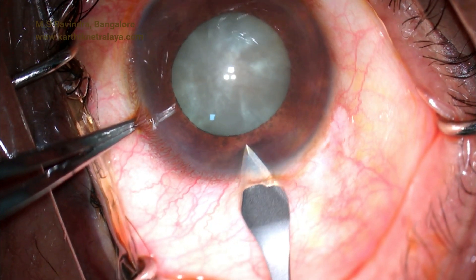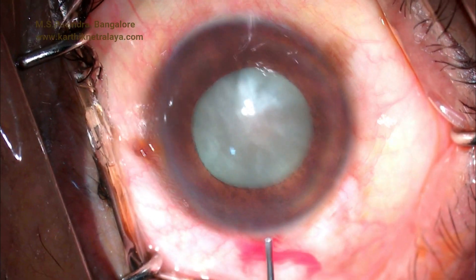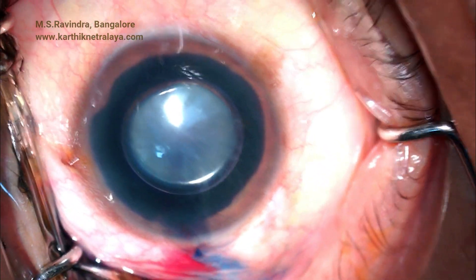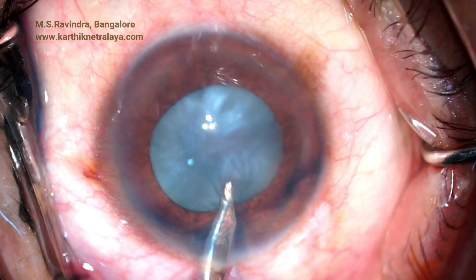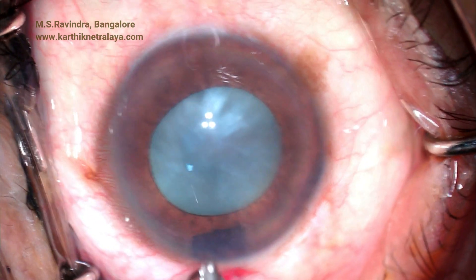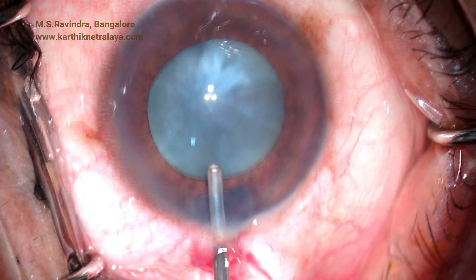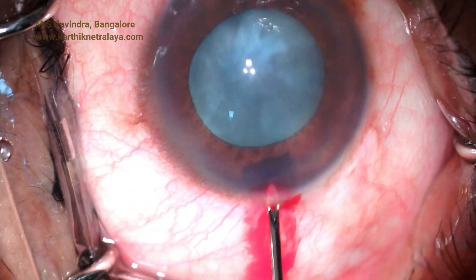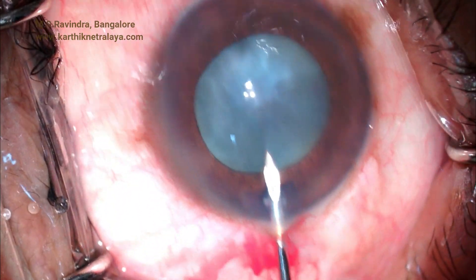An over-mature Morgagnian cataract appears to have a very tense capsular bag. A 2.8 mm entry is made, and trypan blue staining is performed under a bubble of air. The air, aqueous, and trypan blue are aspirated and viscoelastic is injected. This prevents positive pressure in the anterior chamber from creating migration of trypan blue through the zonules into the vitreous cavity.